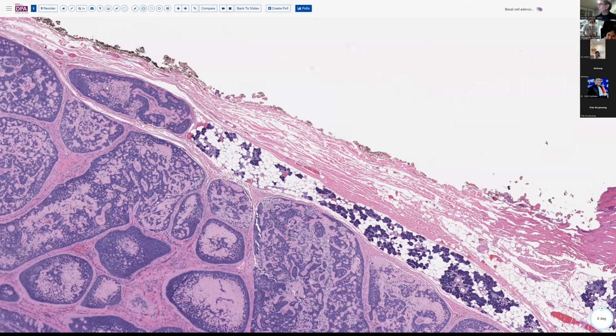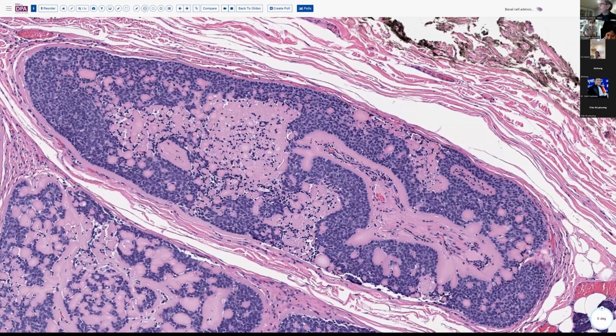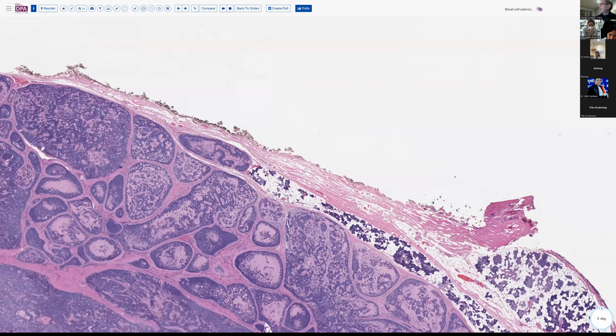So, this is not the most clear-cut example of basal cell adenocarcinoma in terms of demonstrating invasive behavior. But you could certainly begin to be concerned for that on the basis of these two nests sort of beyond the usual encapsulation of the lesion, and want to more fully examine it.